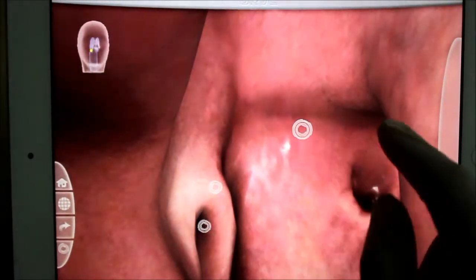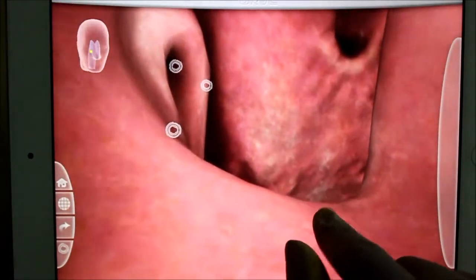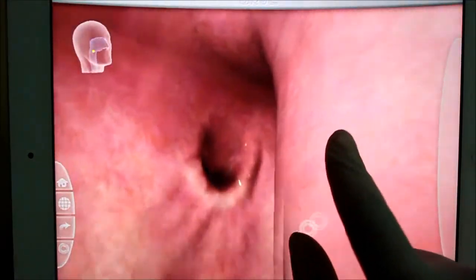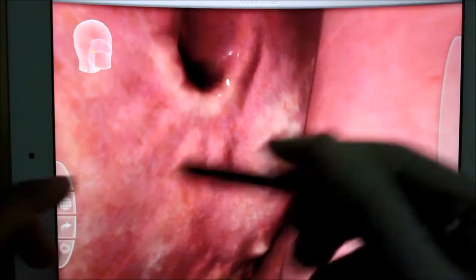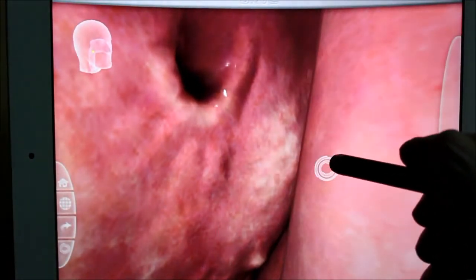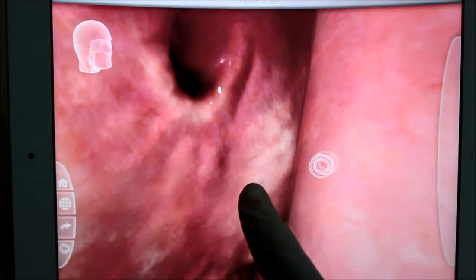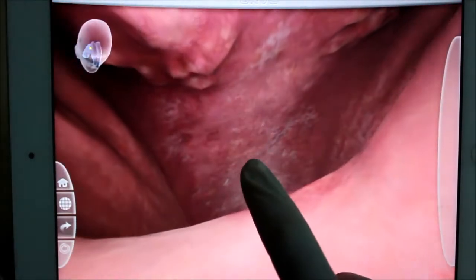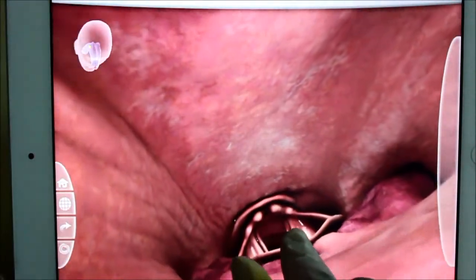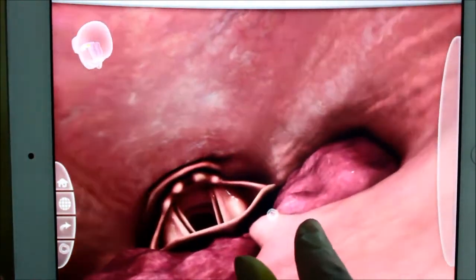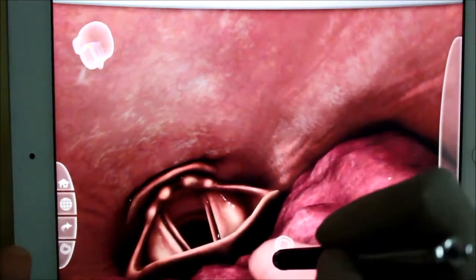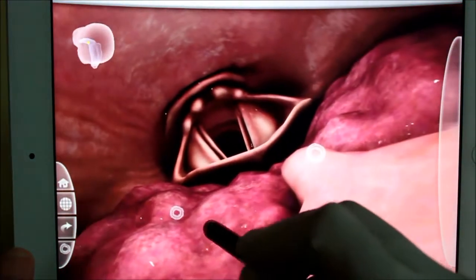nasopharynx. It is the posterior choana. Now moving downwards, it's the end of the nasal septum. You can see the vomer. Now as we go down we will see the uvula.